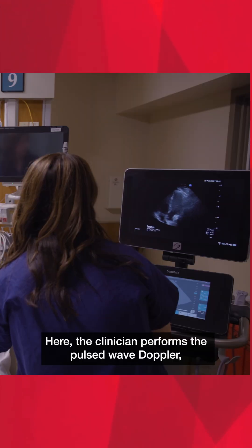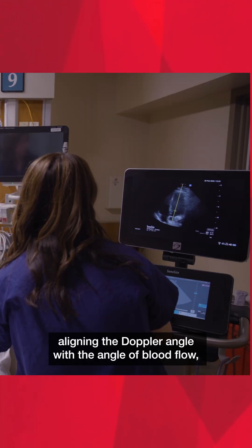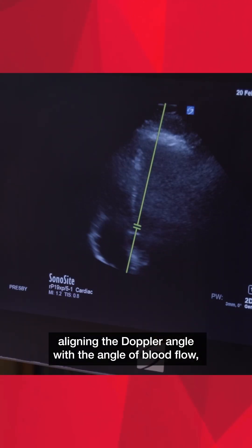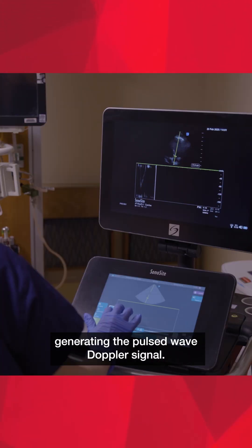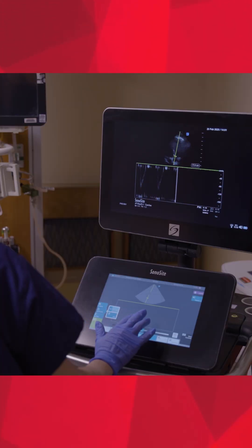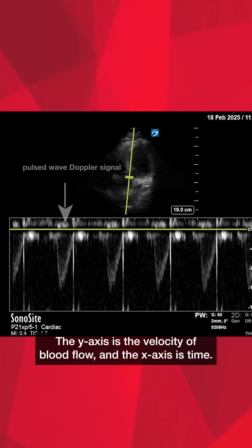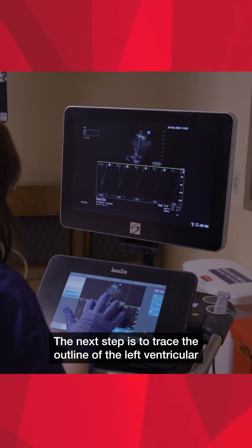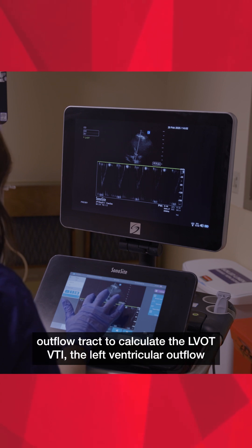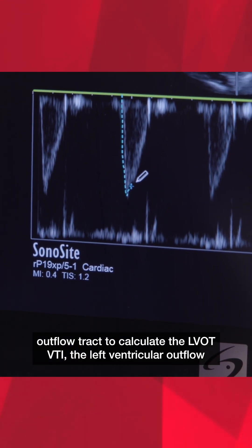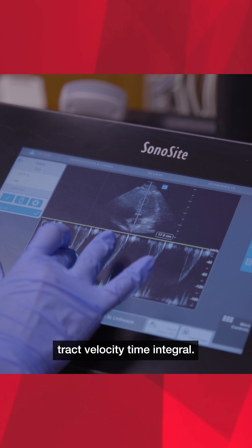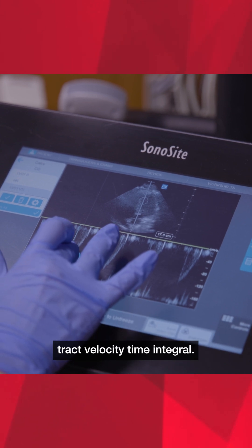The clinician performs pulse wave Doppler, aligning the Doppler angle with the angle of blood flow, generating the pulse wave Doppler signal. The y-axis is the velocity of blood flow, and the x-axis is time. The next step is to trace the outline of the left ventricular outflow tract to calculate the LVOT-VTI — the left ventricular outflow tract velocity time integral.